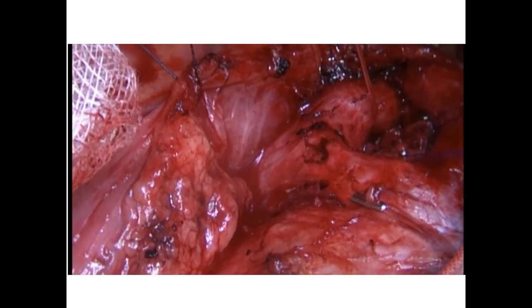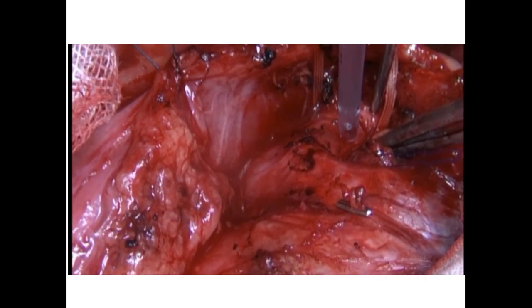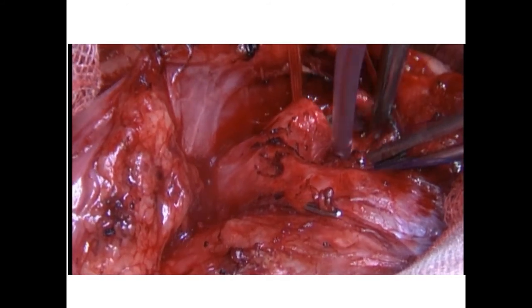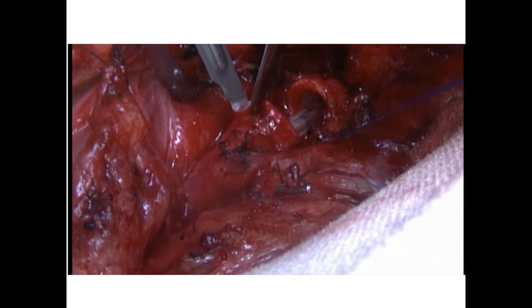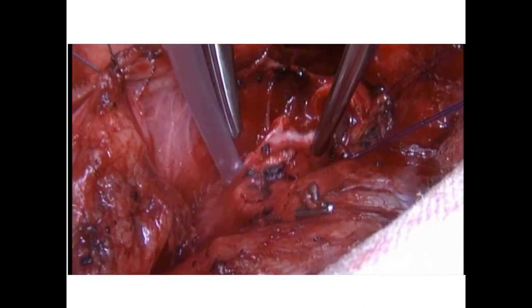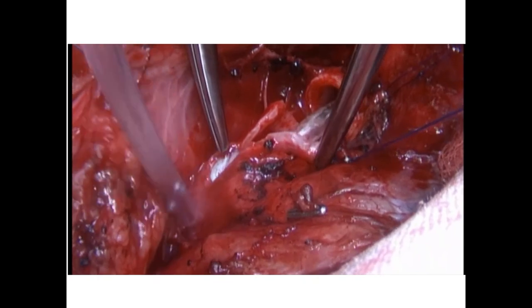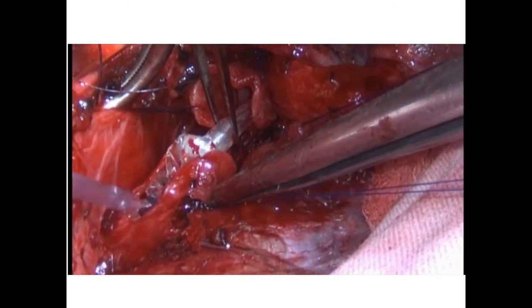Here we see the video of that operation. First we see the thoracotomy. And then we see a view from inside the thorax. The distal trachea and the left and right main bronchus are identified. And then the trachea is cut through. Next there is a longitudinal transection from the trachea to the left main bronchus. The right tube cuff becomes visible. Ventilation is going on, there's no problem. Then the reconstruction is performed with ongoing ventilation of the left lung. No ECMO was needed.